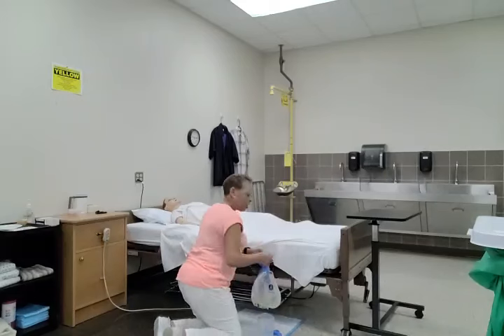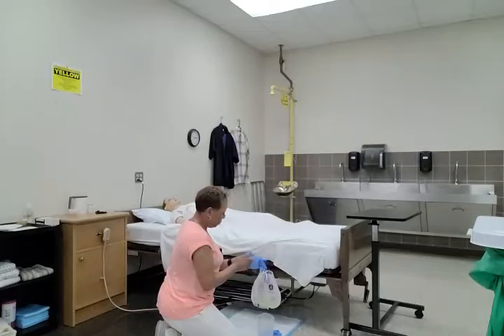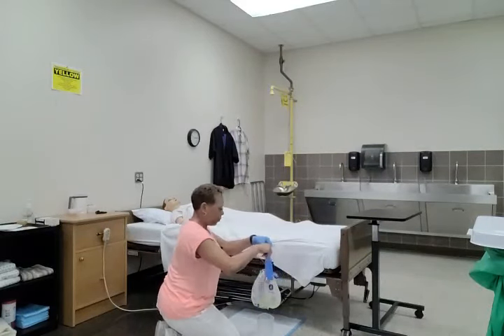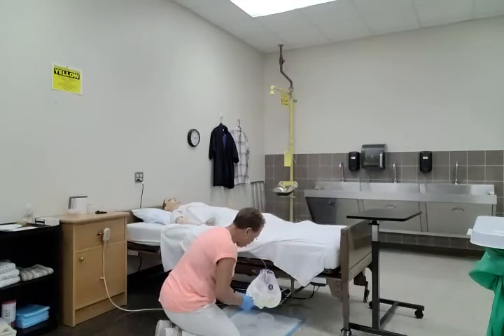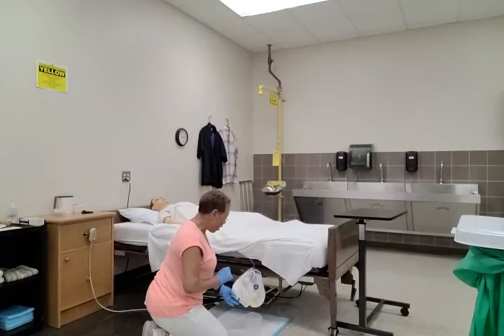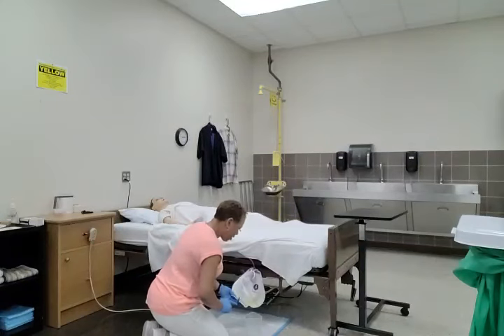The first thing I'm going to do is put on my pair of gloves. I'm going to look at the valve to make sure that it is closed, because you don't want to remove the drainage tubing from the holster if the valve is open — if it is open and you remove it, you're going to have urine all over the place. So this valve is closed.